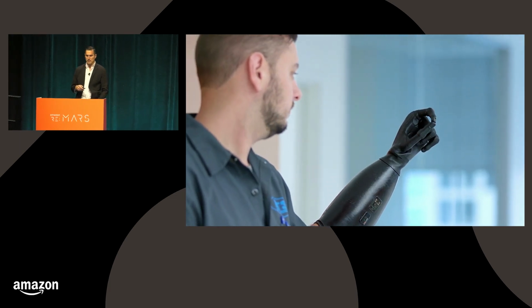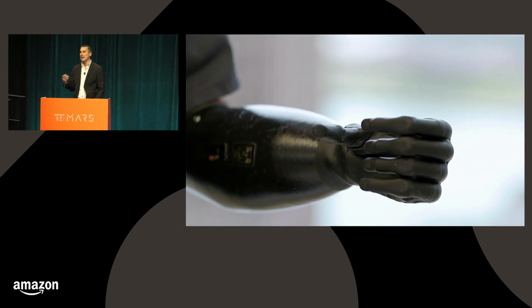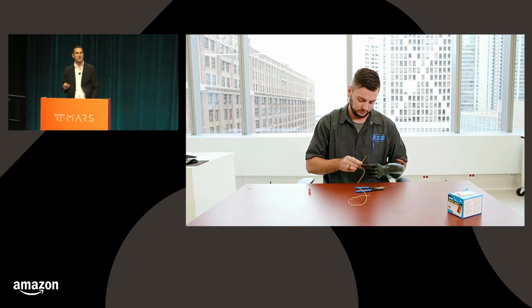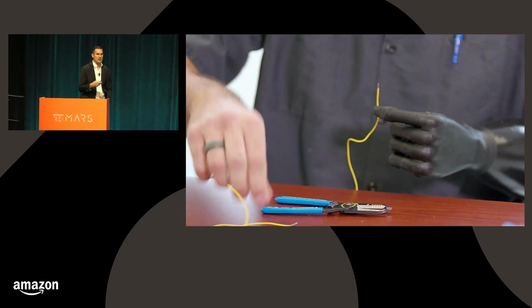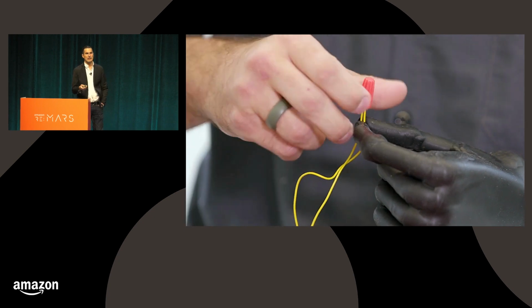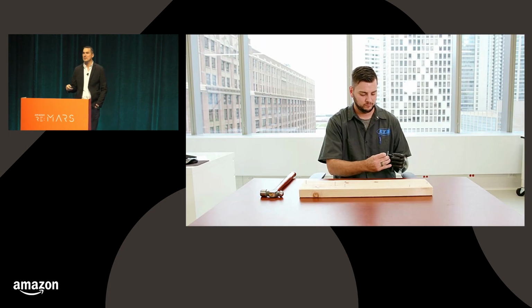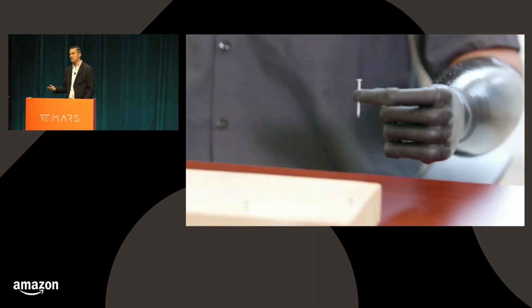Now, over the past 10 years or so, there's been some impressive advancements, especially in upper limb bionic limbs. We have multifunction hands and arms that can replicate many of the natural motions of the human hand. In fact, you may have seen some of this technology actually out in the public. But you haven't seen bionic legs in the public. And the reason for that is the risk associated with the control of bionic leg systems.